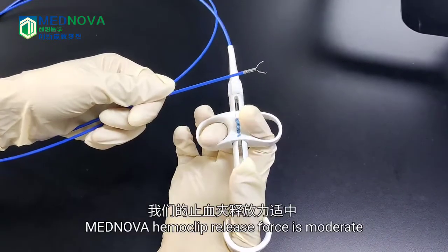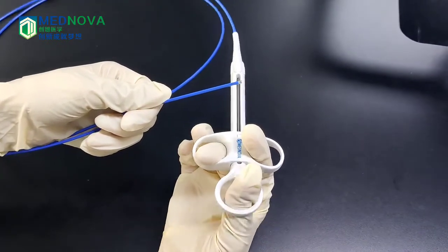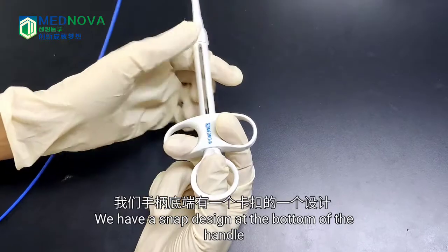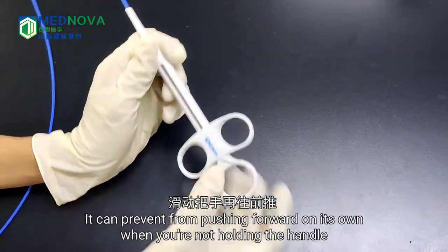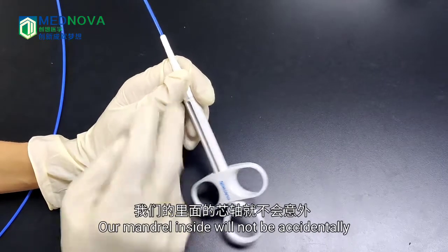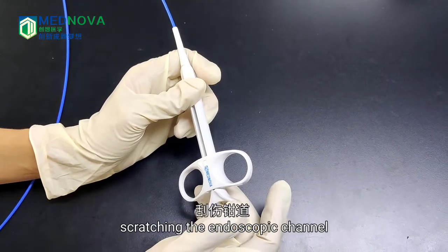MagNova Hemaclip release force is moderate and can be released smoothly with one hand. Two fingers pull the sliding handle to the bottom of the handle. We have a snap design at the bottom of the handle. After pulling the sliding handle to the bottom, it prevents the handle from being pushed forward on its own. In this way, the handle inside will not accidentally be pushed outside of the spring tube, scratching the endoscopic channel.